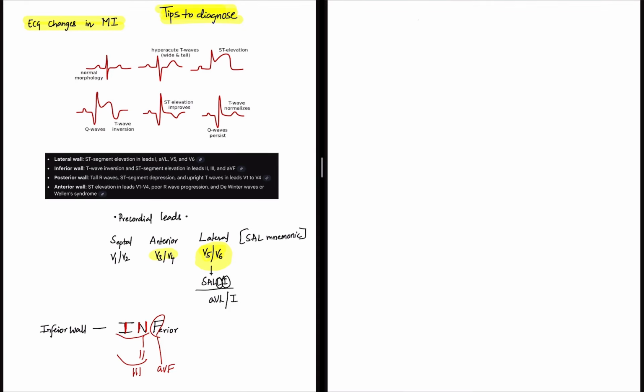In this video, we'll quickly discuss what are all the ECG changes that we see in case of different types of MI. So when I talk about myocardial infarction, we deal with ST segment elevation MI.